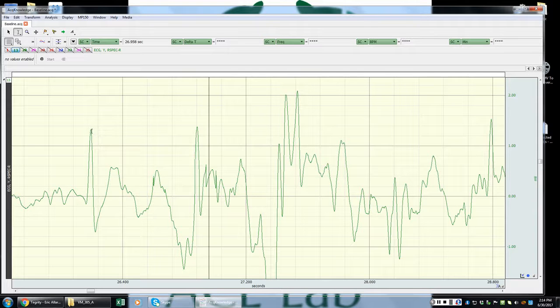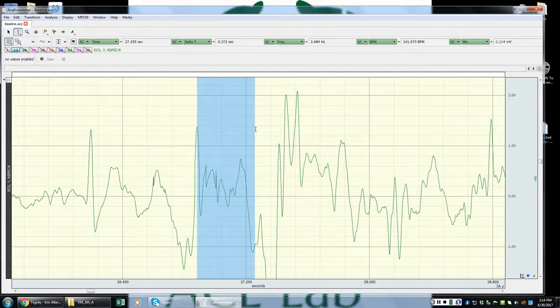Okay, so my distance again is around 0.72, 0.7, 0.74, somewhere in that range. So I'm going to highlight, just scroll over. What do we have here? We're looking at about 0.41, not far enough. We look over here, 0.53, not quite. 0.58, not quite. And 0.64 looks like it's maybe going to be the closest that we're going to have in terms of waves that are reasonable.